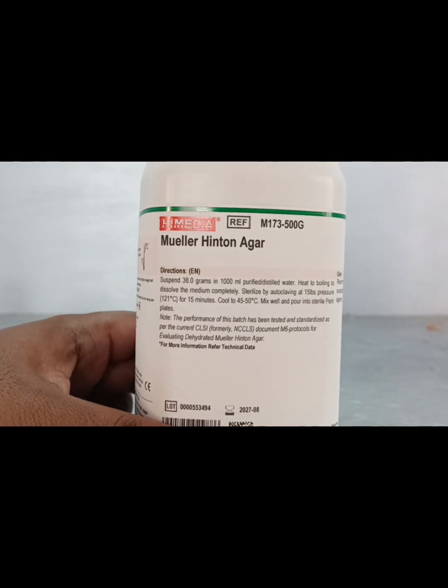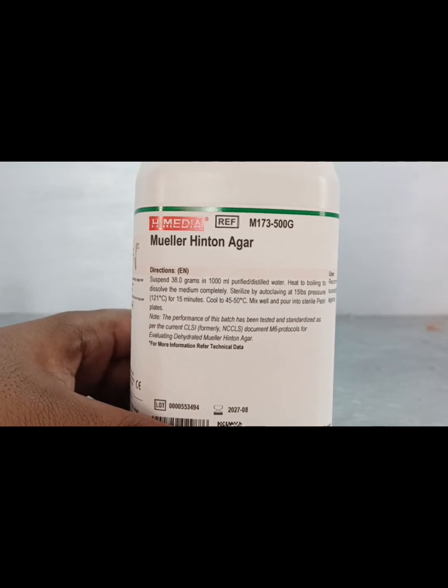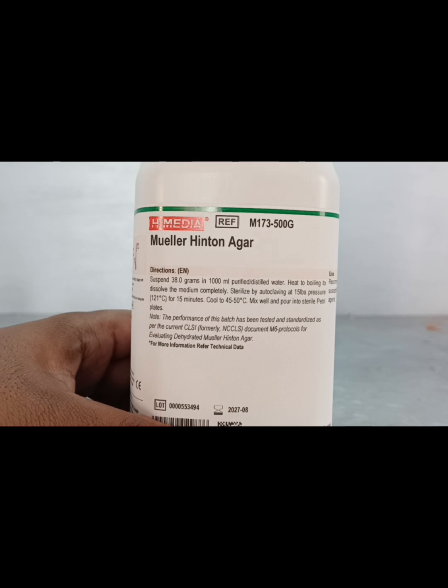As per instruction, 38 grams of agar powder should be dissolved in 1000 ml of purified distilled water. Heat to boil to dissolve the medium completely, then sterilize by autoclave at 15 PSI pressure or 121 degrees centigrade for 15 minutes. Then cool to 40 to 50 degrees centigrade, mix well, and pour into sterile petri dishes.